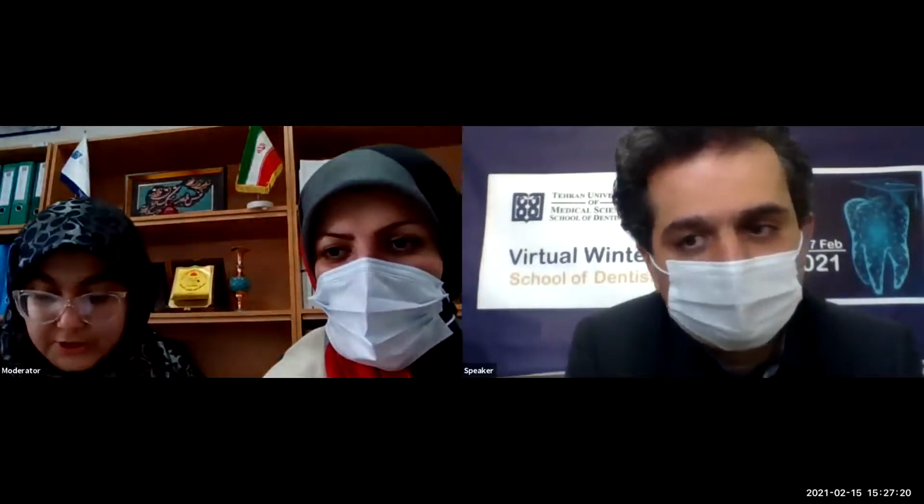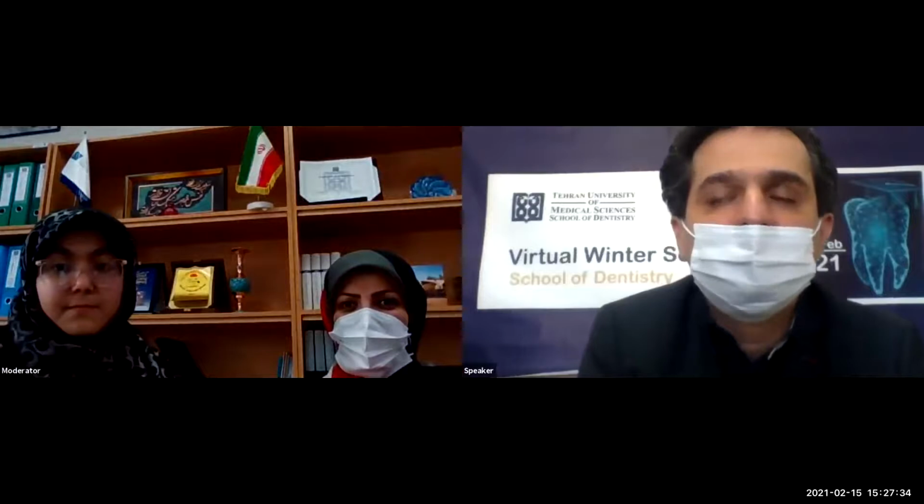What is your idea about using modeling resin? Modeling resin is good for forming and shaping, and sometimes I use it, but in this video I didn't use it. In clinic I use modeling resin from Ultradent company.